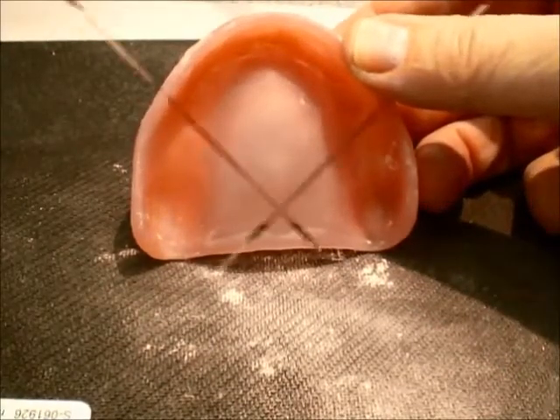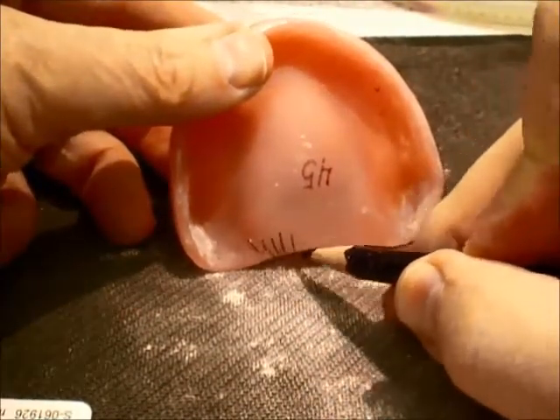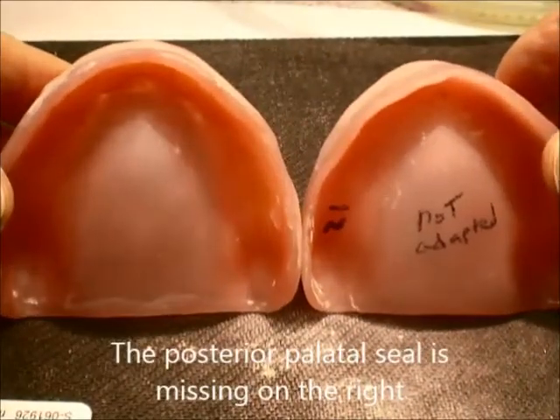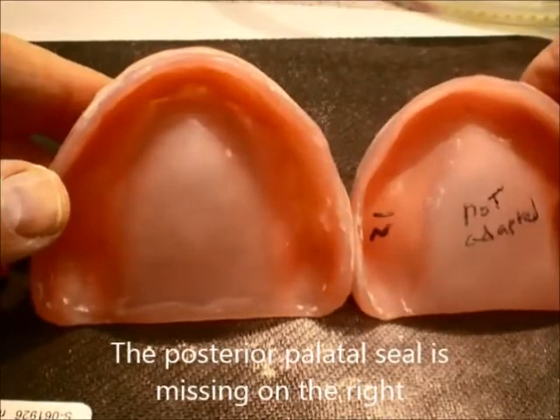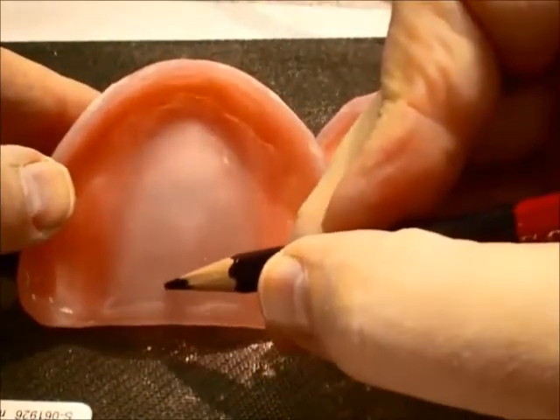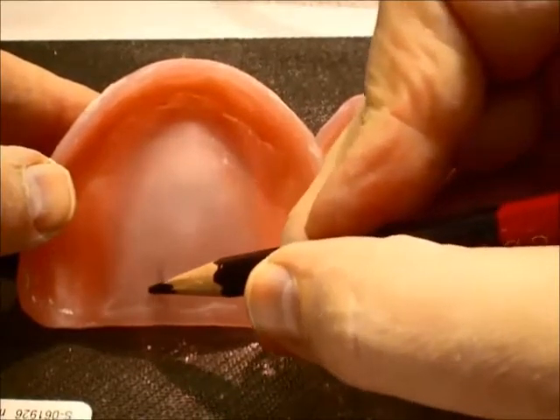You can see the intaglio of the denture. This one does not have the posterior palatal seal area, either because it was not on the cast or it was not well adapted. When using light-cured acrylic, you have to use a little extra caution to make sure it is well adapted. So that is how we do it.